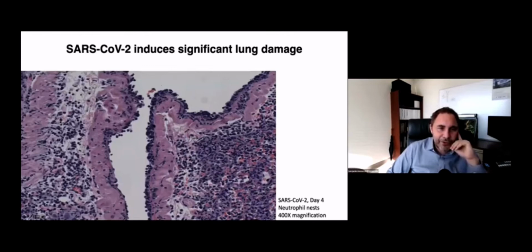So these are neutrophils upon neutrophils. So what you should really see is something more like this, where a single neutrophil is coming to the site of infection. It's seeing that chemokine gradient, that call for reinforcements we talked about, and it's coming to the site of infection in order to be activated and induce some kind of inflammatory response.